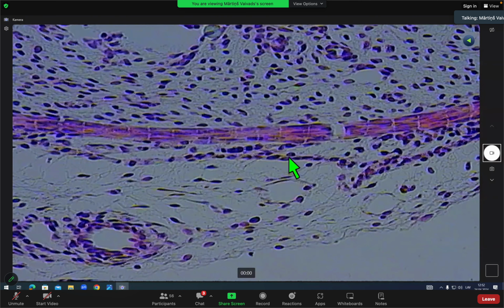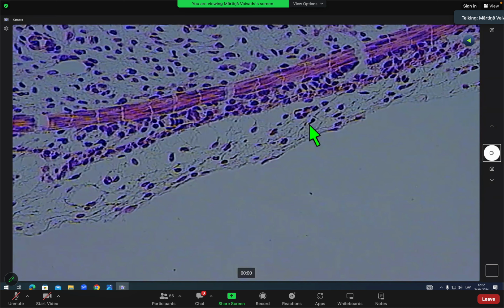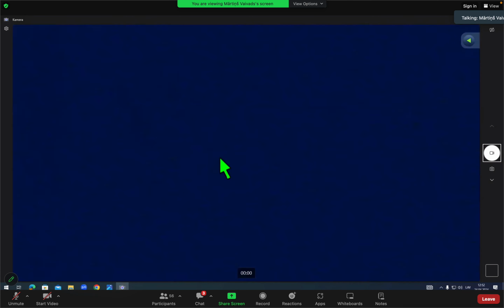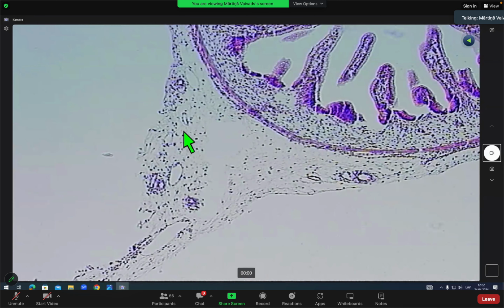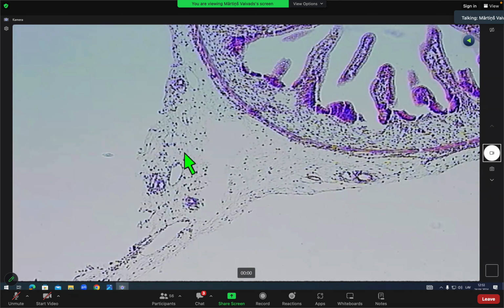And then the serosa. This slide is interesting because the serosa is thickened here. You can see a lot more mesenchyme, some mesothelium. And one thing that you can also add as an additional label, it's not in all slides, you can see this area. There are blood vessels with mesenchyme in the wall of the intestine. This is called mesenterium.